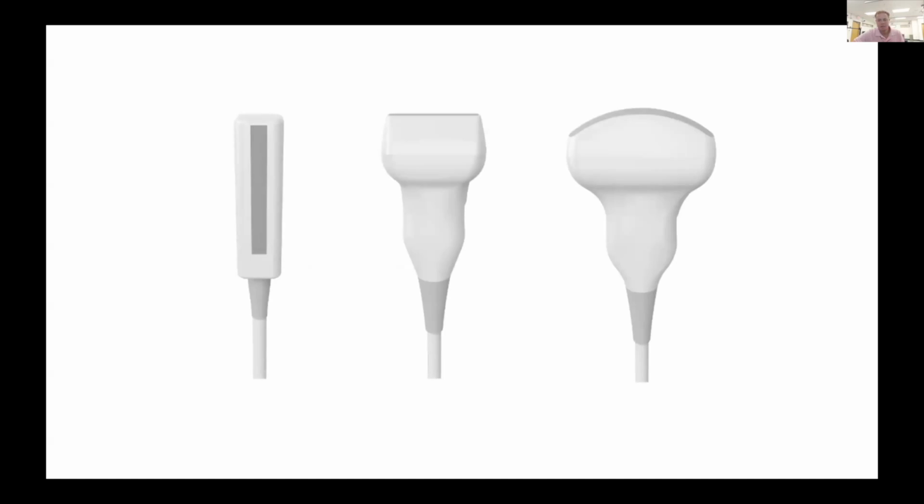Okay. So again, when we typically think about an ultrasound probe, we think of it in these form factors here on the right. And that's great if we want to do freehand medical ultrasound imaging.